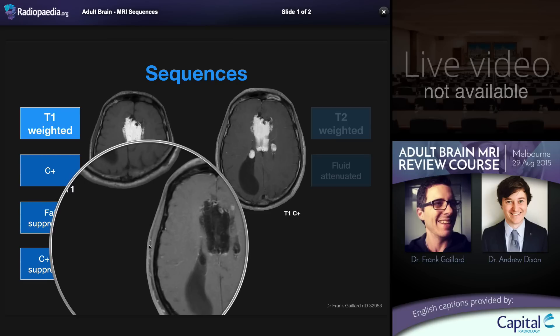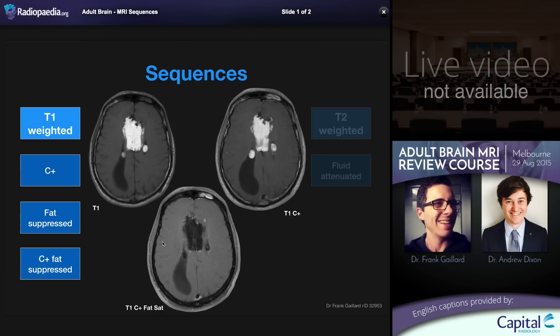Note that in the scalp it is the subcutaneous fat that becomes dark, with the scalp remaining hyperintense post-contrast due to the administration of gadolinium. Fat saturated post-contrast T1 sequences are routine in most parts of the body because of the presence of significant amounts of fat. This is not the case in the brain where fat is an abnormal substance, and so for purely intraparenchymal lesions fat saturation is usually not performed. The exception is intracranial masses involving the skull or skull base where extracranial extension is being sought — most commonly base of skull meningiomas or cerebellopontine angle masses.